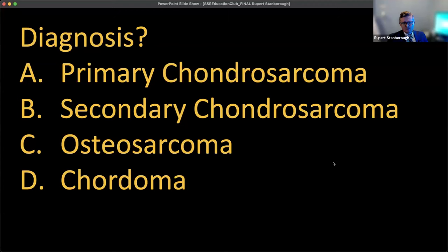Now I want you to make the diagnosis. Is it A, a primary chondrosarcoma? B, a secondary chondrosarcoma? C, osteosarcoma? Or D, a chordoma?